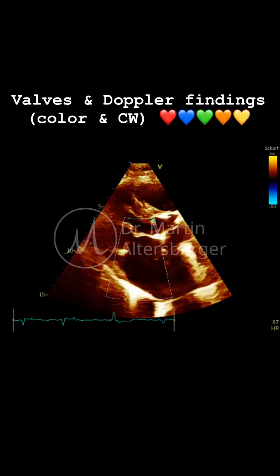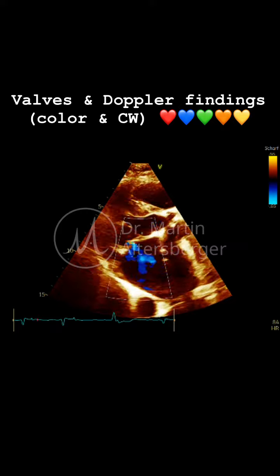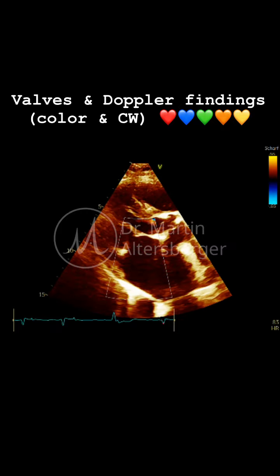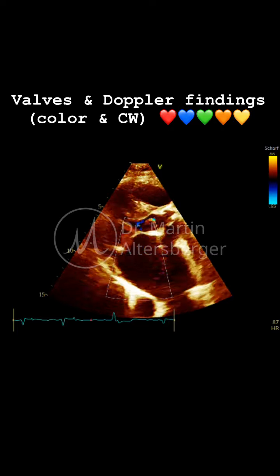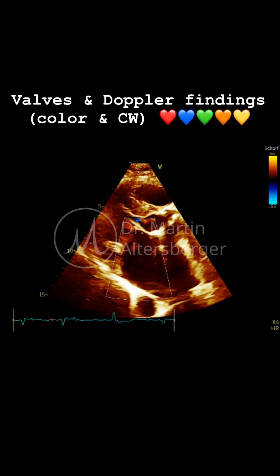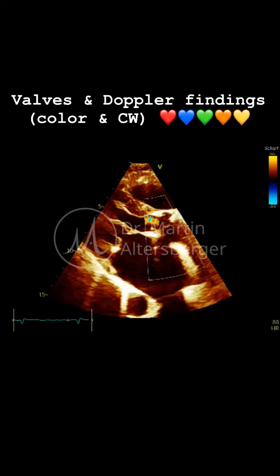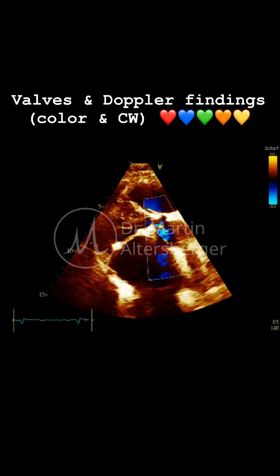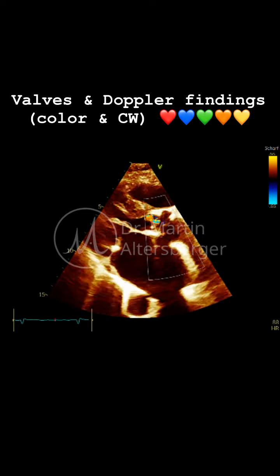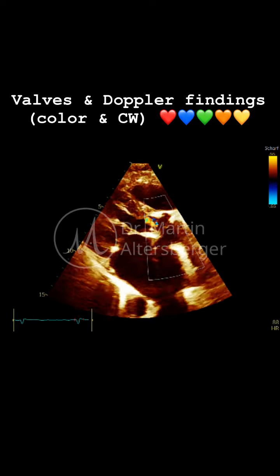The evaluation of heart valves with Doppler starts in the parasternal long axis view already. You will use the color Doppler to visualize, in this case, mitral regurgitation. It's probably mild to maximally moderate, but we also do get a glimpse already of the stenosed aortic valve, and there we see that there is turbulent flow across the valve, showing the stenosis into the ascending aorta, but also AR.